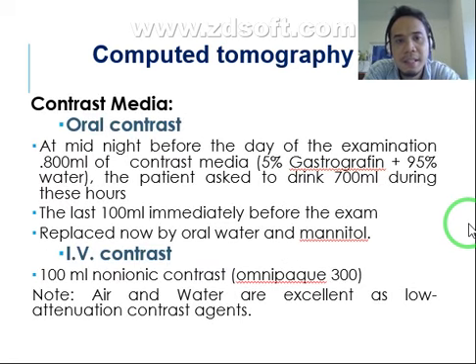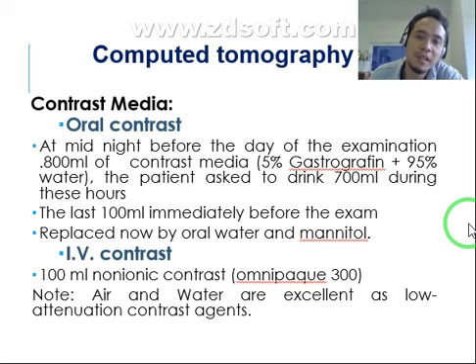So contrast media to be used for abdominal CT scan is oral contrast and IV contrast. Okay? Again, different protocol sa hospital, mag-vary po siya. Okay? So maybe this protocol nga ako i-mention is not applicable for any institution, okay? And applicable sa other institution. Okay? It depends sa protocol sa institution.